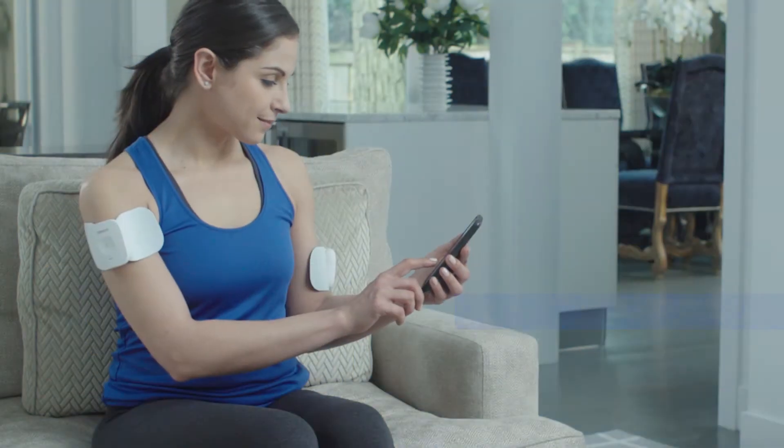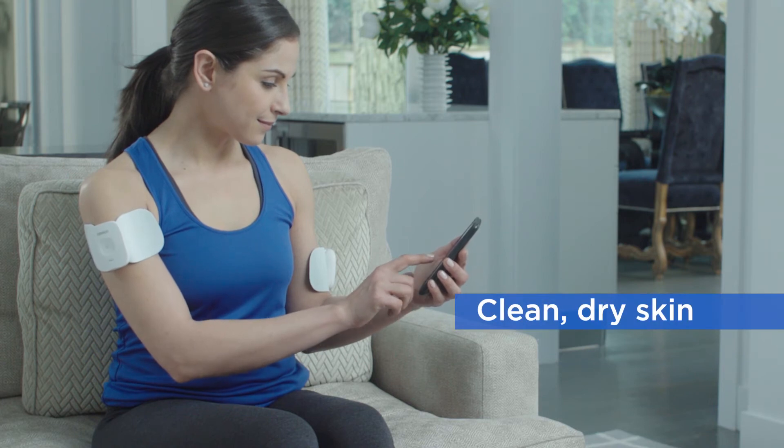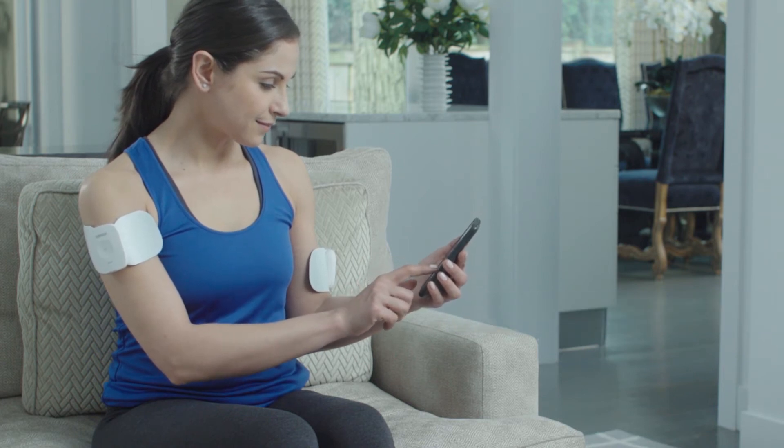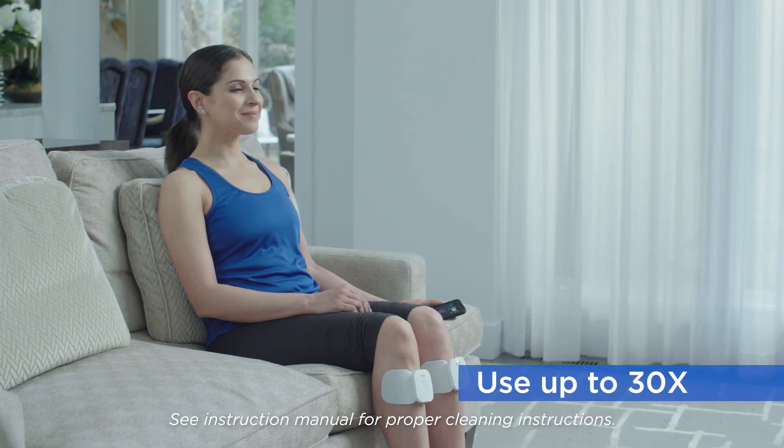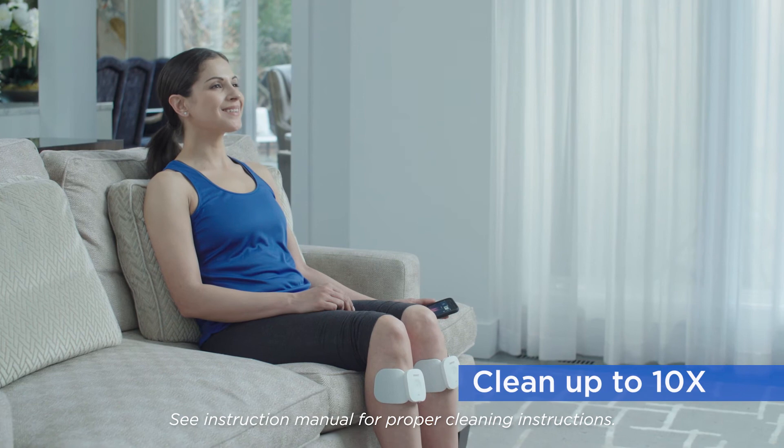Be sure to use the pads on clean, dry skin. If you are using both pads at once, make sure the pads are at least 1 inch apart. Each pad can be used up to 30 times and cleaned up to 10 times.